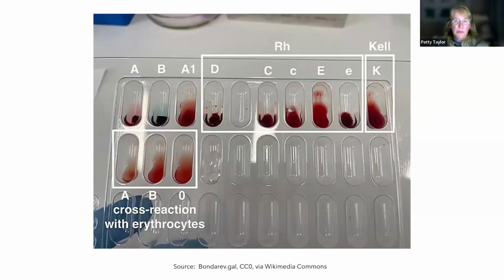And just to show you a couple of others, for instance, the one that's outlined in a white square near the bottom that says ABO, you'll notice that those three didn't have a reaction. So depending on how this is done, the reaction may look like the blood has clumped a little bit or clotted up, but it's not clotting, it's agglutinating. That's because the antibodies can bind antigens. So that's what we're looking for to distinguish if we've got a reaction or not.